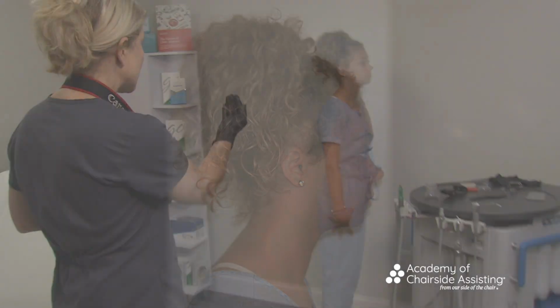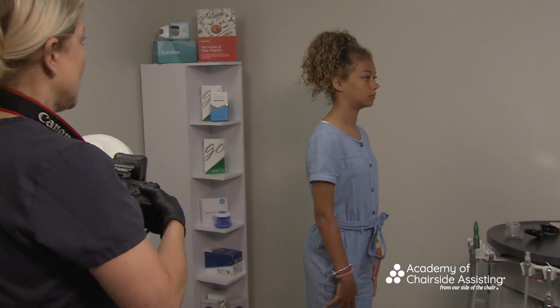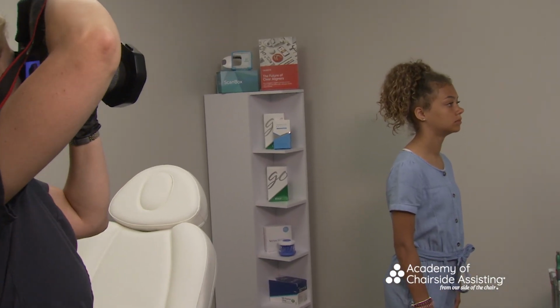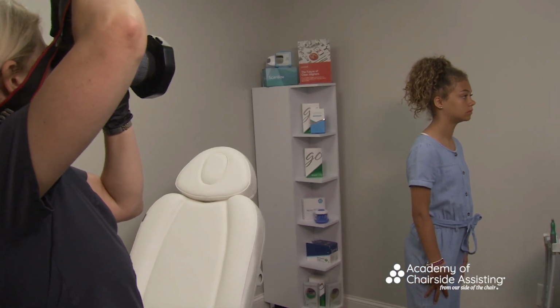So one of the things that I want you to look at is a little bit of that shadow. You see that shadow behind her? I don't want that. And I can tell you the orthodontist is not going to want that either. So Kylie, take one step towards me. There we go. And I'm going to have to back up, right? But I don't have that shadow.